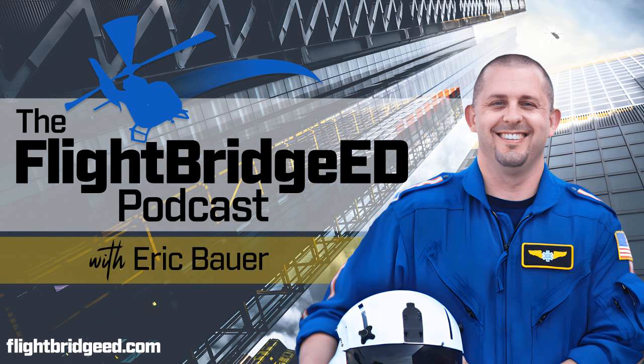You can also see this when you push your respiratory rate. So if you're listening to this podcast and you haven't noticed that, go turn your ventilator on and push respiratory rate, and you'll see it pop up, and it'll probably say ICalc. Because again, your respiratory rate directly affects your I:E ratio. We only have so much time to deliver our breath and then exhale. All right, so let's move on.